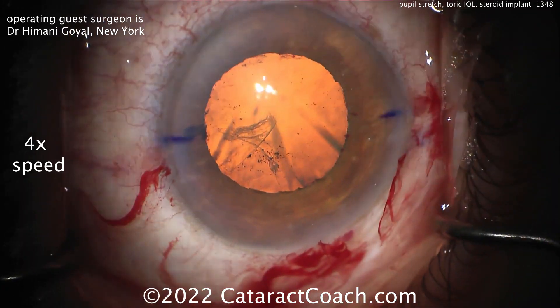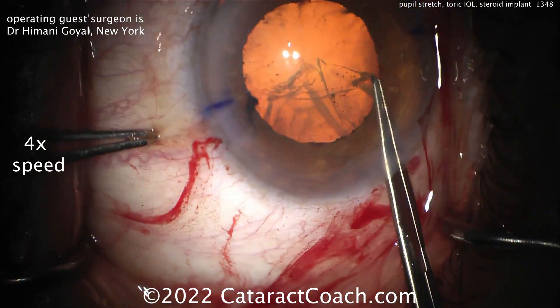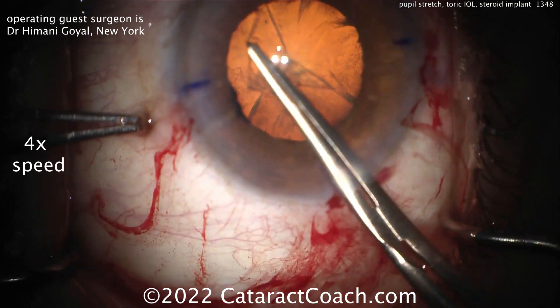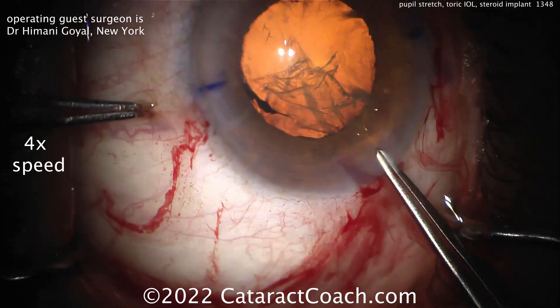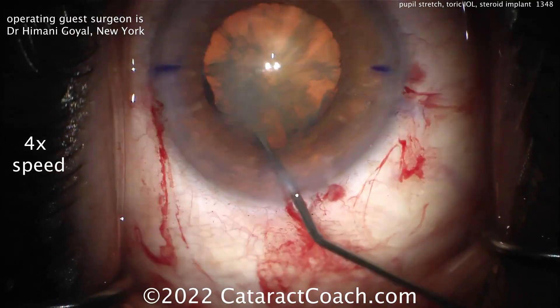I want to show you the whole video, so I'm showing it at four times normal speed. Here you've got an expert surgeon, Dr. Goyal, who's taking about 20 minutes to actually do this case, so four times normal speed is about five minutes. Taking your time — this is a tough case. You can see the patient also has a peripheral iridotomy. This patient's probably on the hyperopic side as well, with a shallower AC. Nice-looking rhexis done. Nucleus is spinning — that looks great.